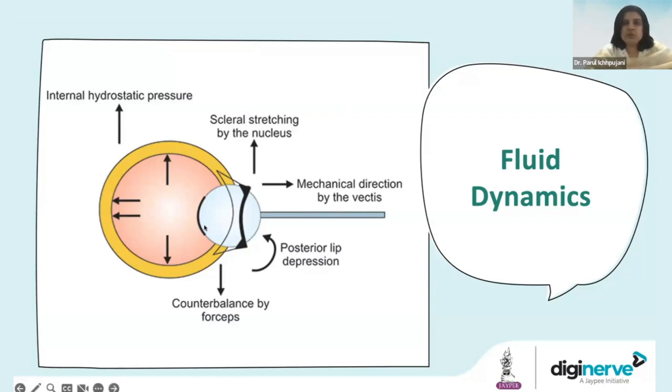So for the smooth nucleus delivery outside, important thing is that you are well supporting the nucleus, the section is large enough, and when the nucleus is moving ahead, your lens hook should also move along with it so that it keeps pushing it out.